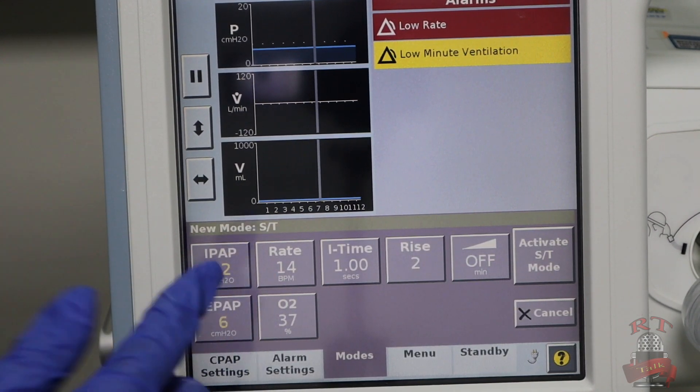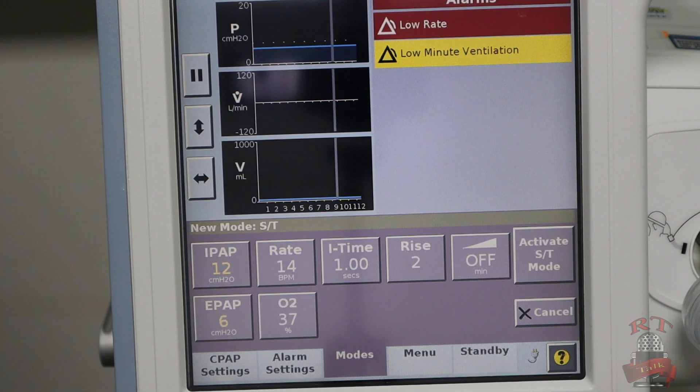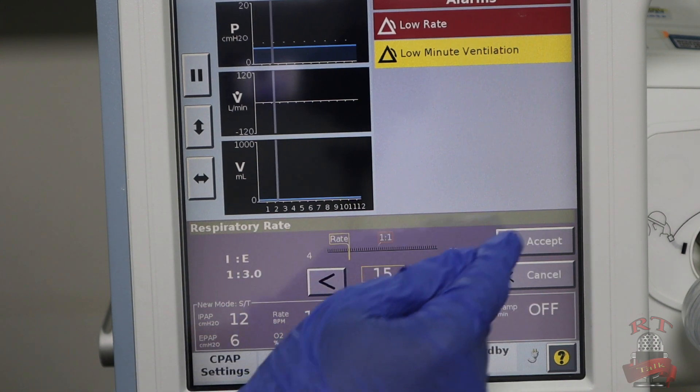Then you will go to the rate. It depends on the age range you are dealing with. If you are dealing with an adult, you will start with 12 up to 20, and it's working as a backup rate. If you are in pediatrics, you will keep it in the range of 16 to 25. It depends on the category of patient you are dealing with. For me, I will keep it at 15.